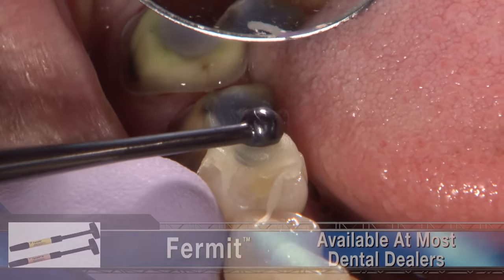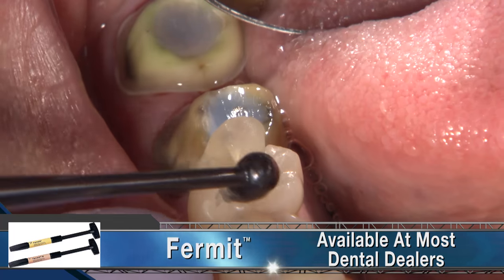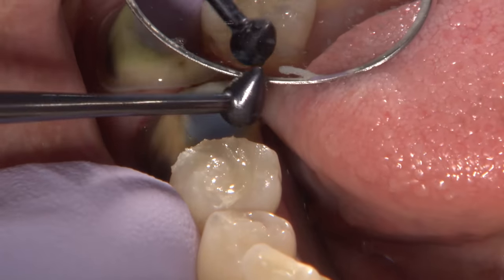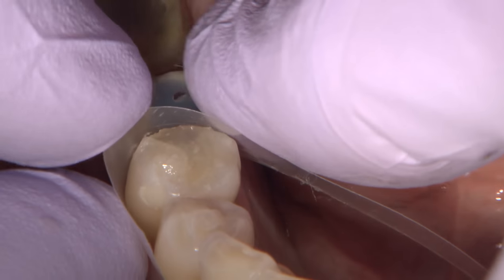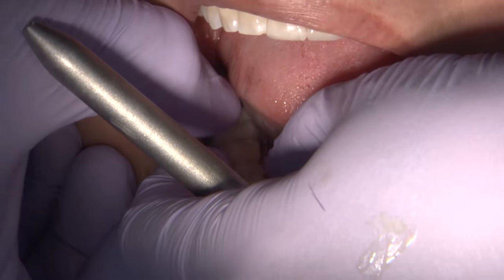Because immediate dentin sealing was done for number 29, I prefer to temporize the cavity with Fermit rather than having it part of the Biotemp unit. I do this to avoid any interaction of the reline material with the freshly bonded surface. This will prevent any adherence of the freshly bonded surface with the provisional resin.